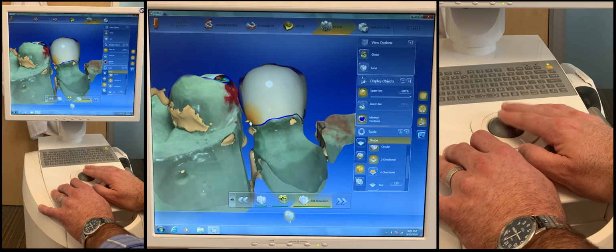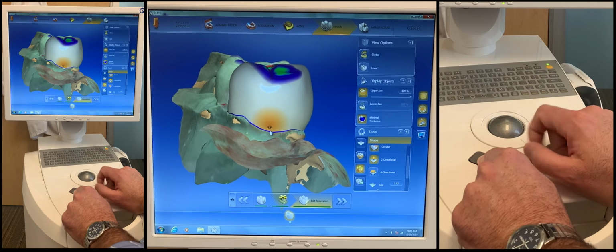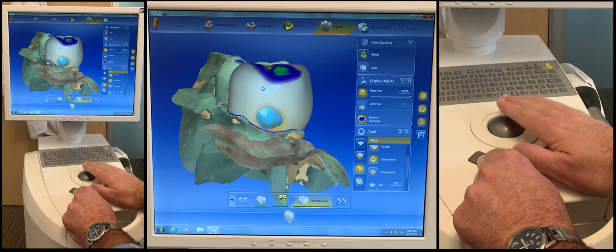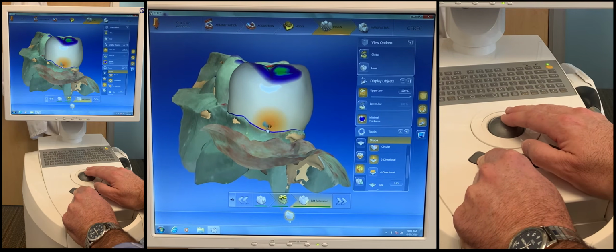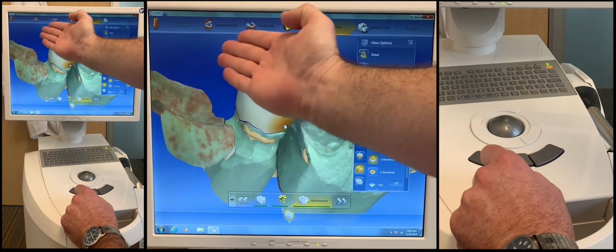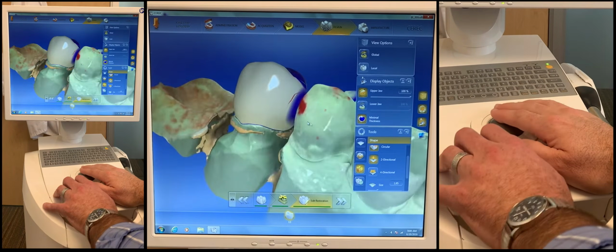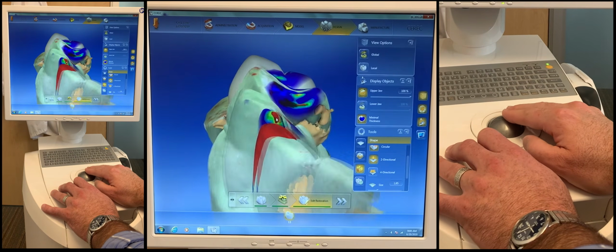But I'm going to pull that out. Just click and drag down. I could push it in and make a real thin spot, but I'm going to drag it just to where that blue disappears. And then I want to verify that I didn't just create a huge lump sticking out of the side of that tooth. All right, so now we've generally got a position that we like.